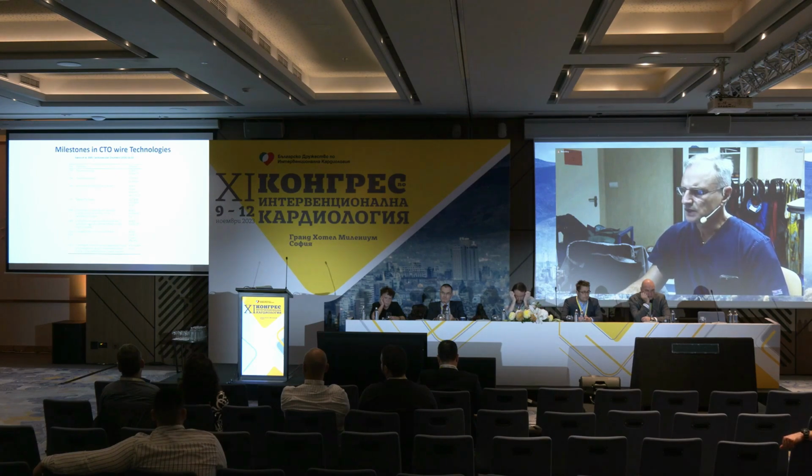enough. The coatings with the polymeric and the hydrophilic since the early days, the incremental tip load, the taper tip design, the combination of the tapering with hydrophilic coating with the tip stiffness more than 9 grams. And then we have all these kinds of combination into the lower range tip stiffness, less than 1 gram with the Asahi Fielder XT. In 2010, 2011, the composite core technologies with the Sion and then the Fielder XT and XTR came.